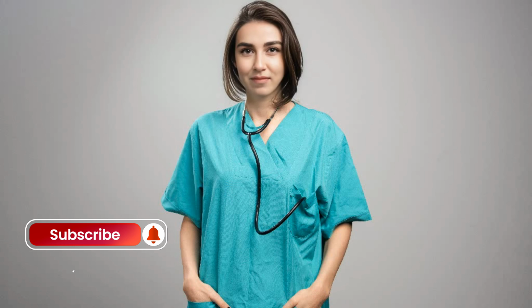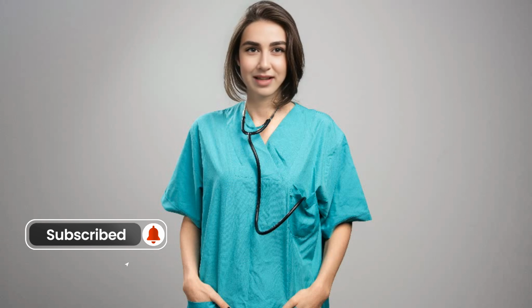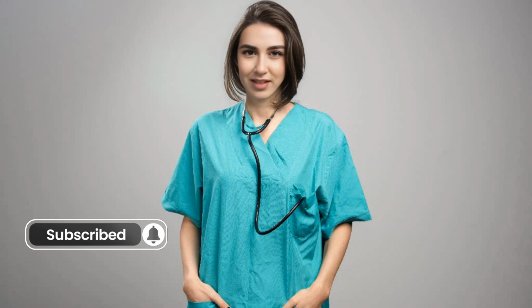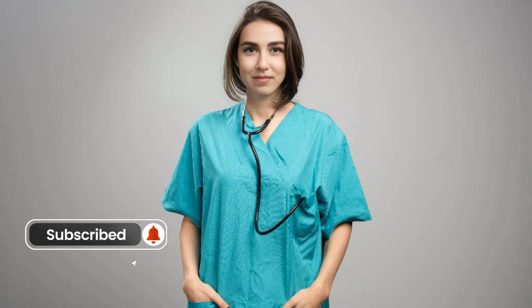2. Balloon angioplasty. Guiding the catheter: the catheter is guided through blood vessels to the site of the blockage. Inflating the balloon: once at the blockage, a small balloon at the catheter's tip is inflated, which compresses the plaque against the artery walls and widens the artery. Deflating the balloon: after a few seconds, the balloon is deflated and removed, which may be repeated to ensure the artery stays open.